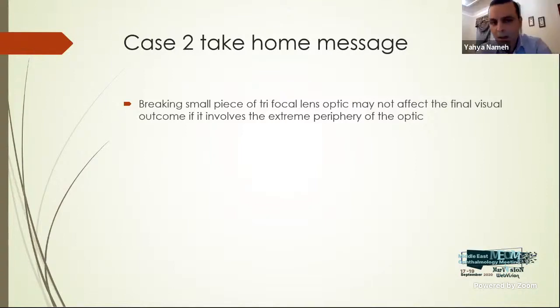Okay. So breaking a small piece of the trifocal lens optic may not affect the final visual outcome if it involves the extreme periphery of the optic. This is what I have learned from this case.